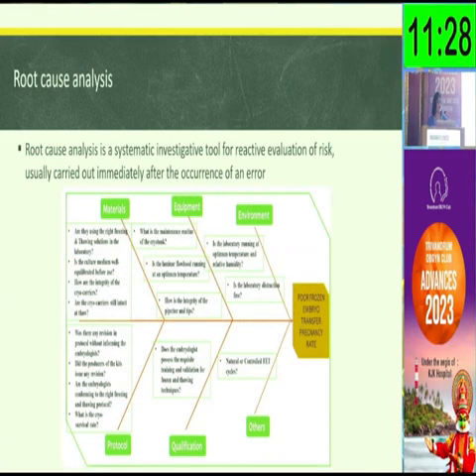When there is a problem, okay, now that I have a problem, my FET results have not been good since February and March. So you need to see what is the root cause analysis. In that, it is not possible to say one particular thing. For example, people who are working in the IVF lab would know, we will look at all the processes, map all the processes again, ensure that we're going through the same. We wouldn't change much, but sometimes the results automatically start coming in.